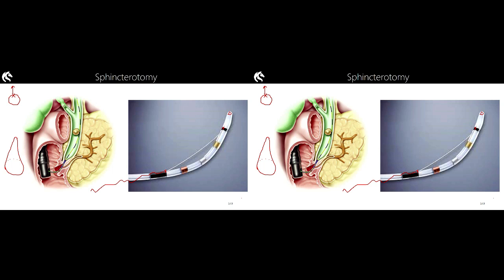I tell you these things because the radiographer is very likely to be the person who puts this gel pad on the patient. Okay? So, you go in to do an ERCP, they go, oh yeah, this patient's likely to have some rocks in their common bile duct, we're going to do a sphincterotomy, and then you'll often be handed a big wobbly gel pad.